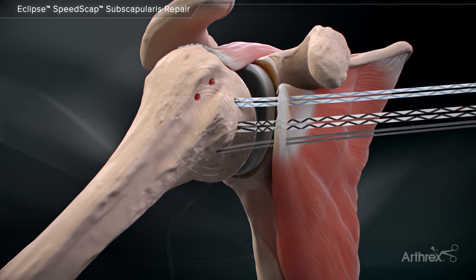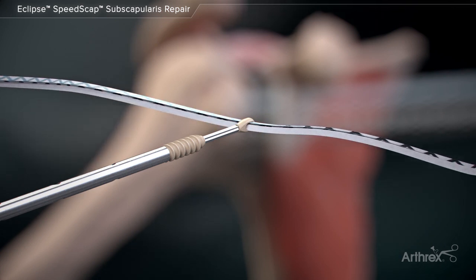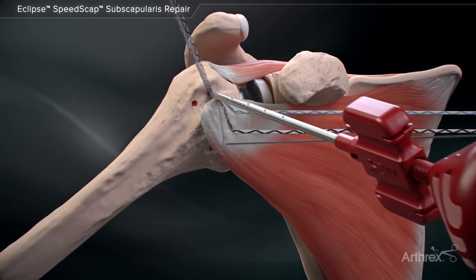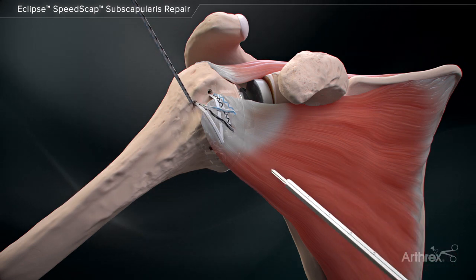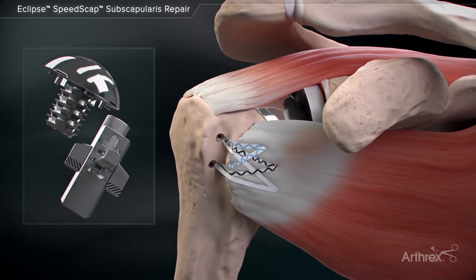Secure one limb from each FibreTac DR anchor, three altogether, and insert through the eyelet of a 3.9 mm swivel lock anchor. Finalize tension of the labral tape suture prior to inserting the eyelet into the prepared socket. This completes the knotless double row Eclipse speed scap repair.